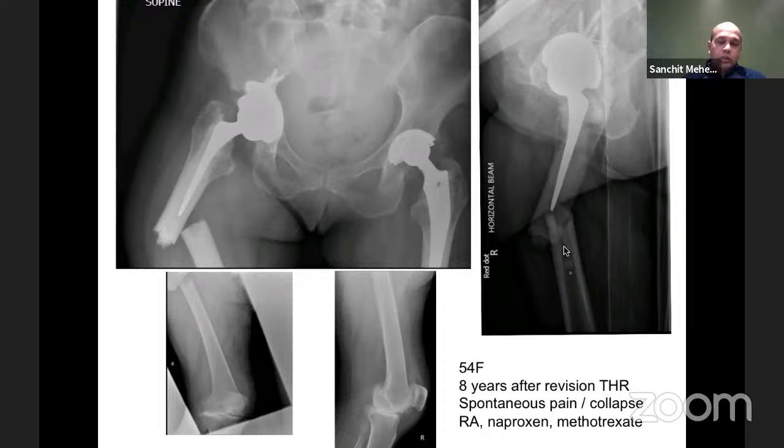So this is almost similar to atypical fractures or bisphosphonate fractures type of thing. The transverse fractures are the ones to be wary of. Okay? So the options again in this case would be to try and span this with a long uncemented implant. That would be a big undertaking. And in the literature, and certainly in the Vancouver group, the things that have failed are this sort of thing, that it is a B2 fracture or a B3 fracture, okay? Where the problem comes is that people identify this as a B1, fix it, and the fixation fails.